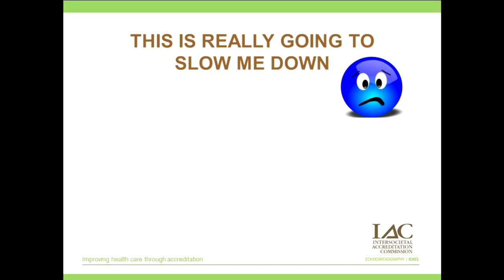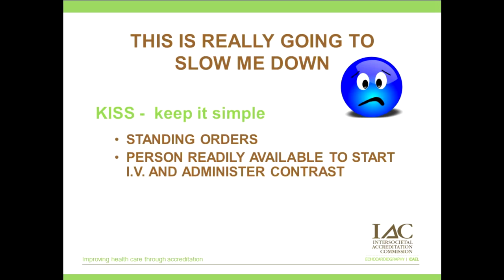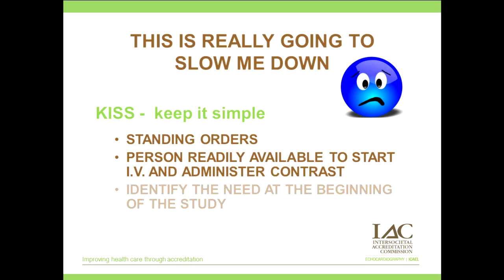Yes, that process will slow you down. What I want to do now is give you 3 ideas on how to make this process more efficient. We really need to try to keep it as simple as possible. First, think about having standing orders. Second, you also want to have a person readily available to start your IV and administer contrast. And finally, it's a great idea to try to identify at the beginning of the study if contrast is needed.